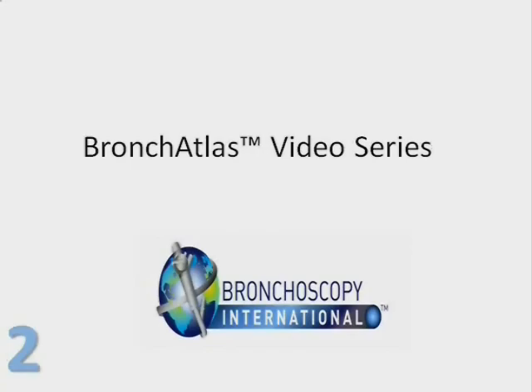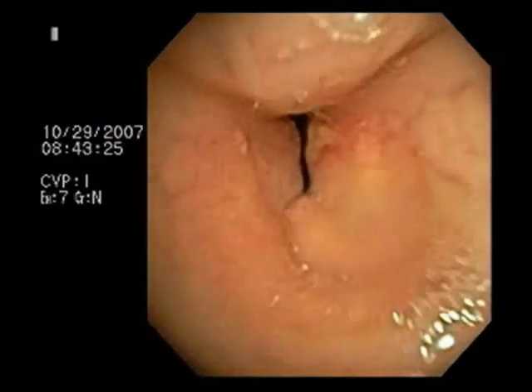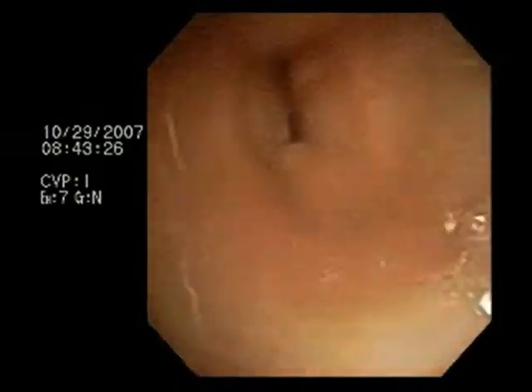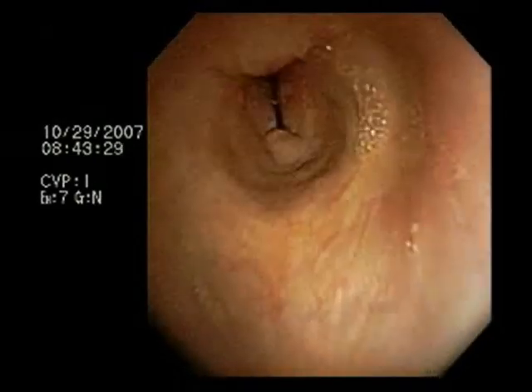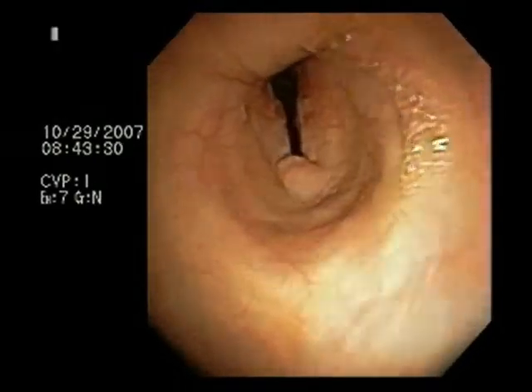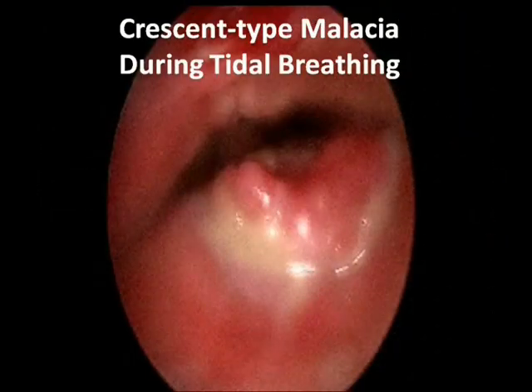In this video, examples of fixed and dynamic central airway obstruction are shown during tidal breathing and during functional, also known as dynamic bronchoscopy, with positional changes.